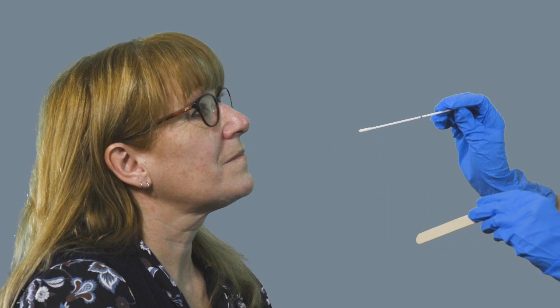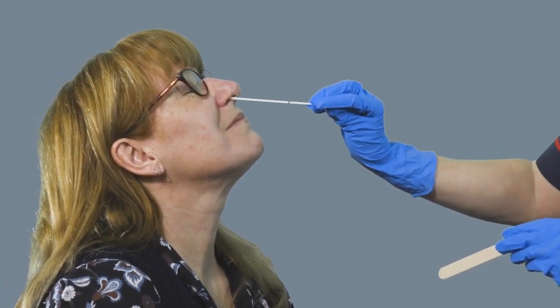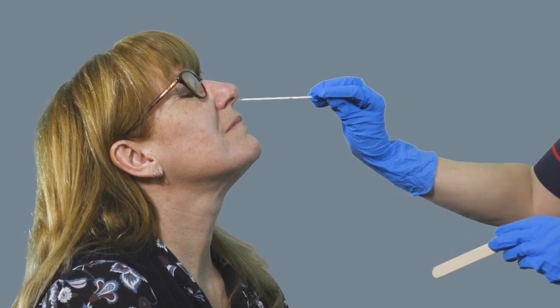Then with that same swab, you're going up either nostril. Start with one and give it a little twizzle round, and then up the other side again and give it a twizzle round.